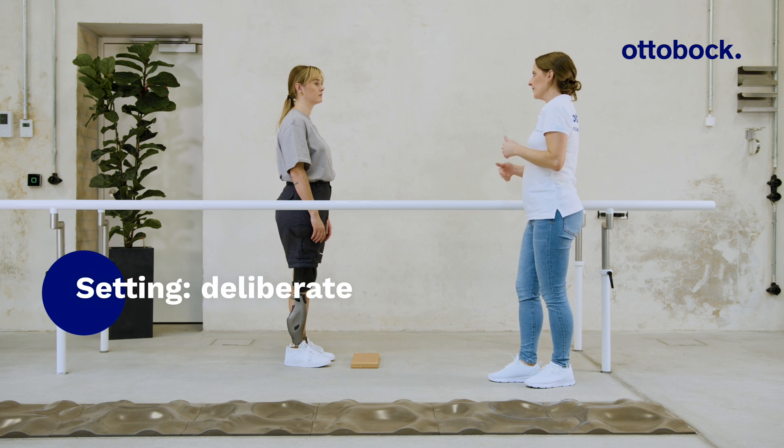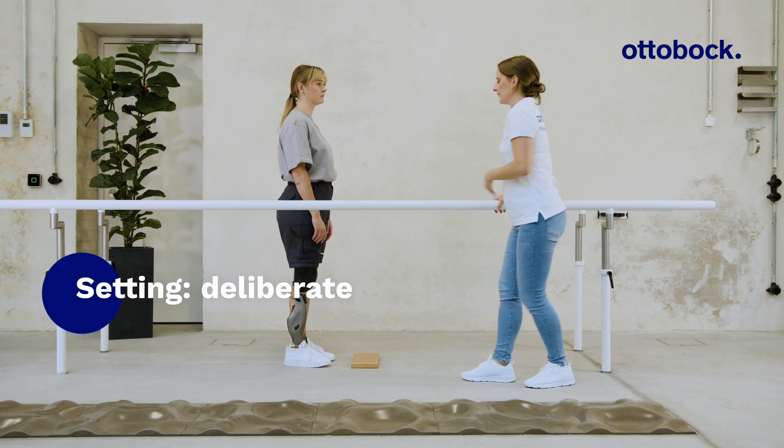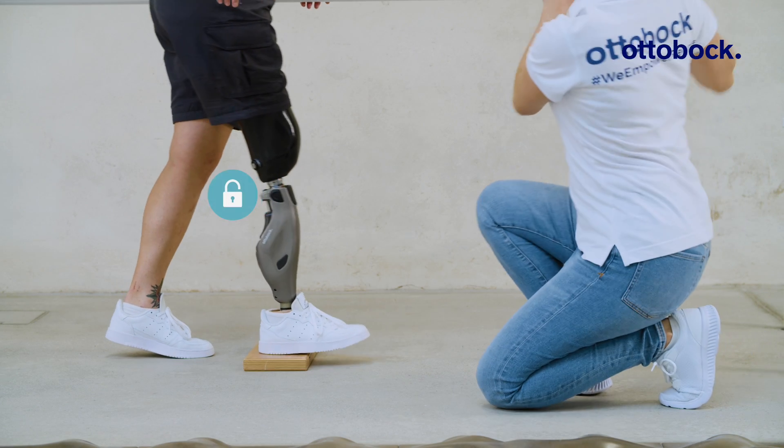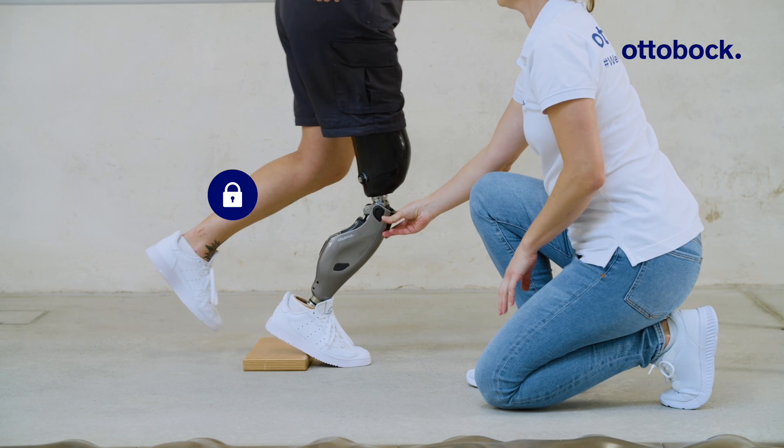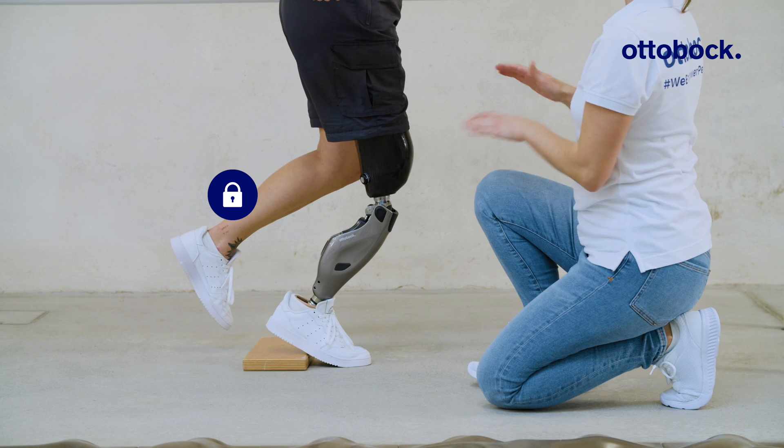With the deliberate setting, the knee must remain flexed, loaded, and still slightly longer to activate the function. Even with forward and backward movements, the knee blocks against flexion.